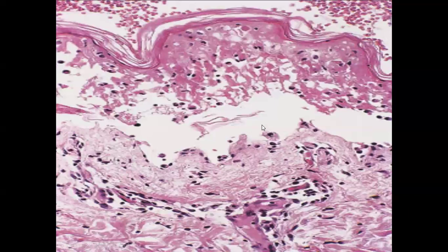And this is another picture. You could see a large subepidermal blister, but the whole of the epidermis in the roof of the blister is also necrosed. Not much inflammatory infiltrate is seen here.